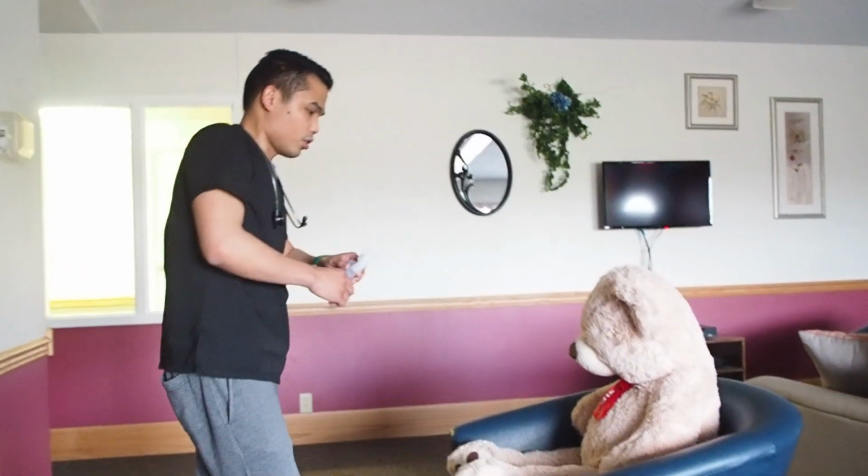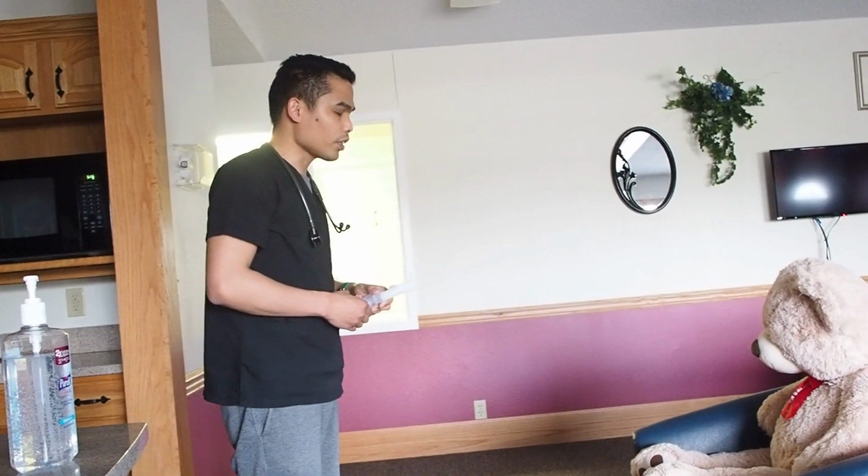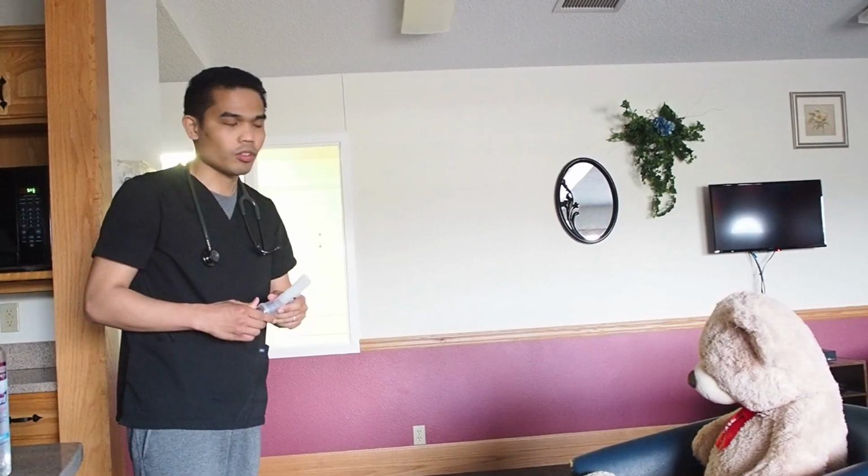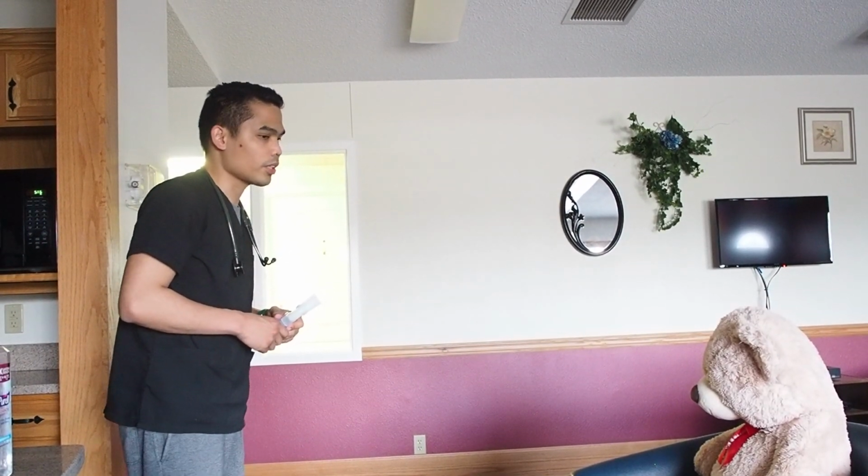Very good. So I'm going to let you rest again for at least a minute for the effect of the medication, and then I'm going to prepare and get ready for the next breathing treatment.